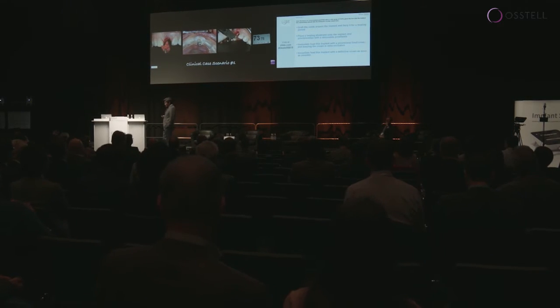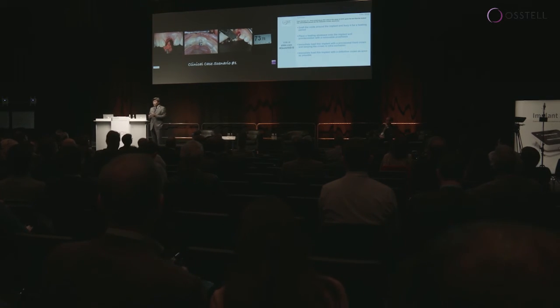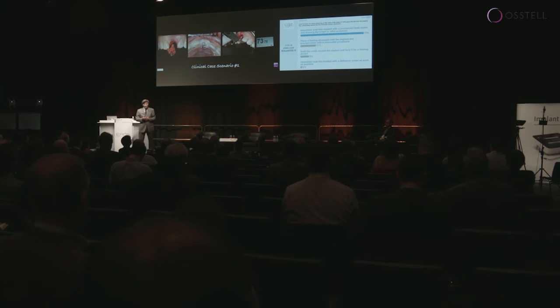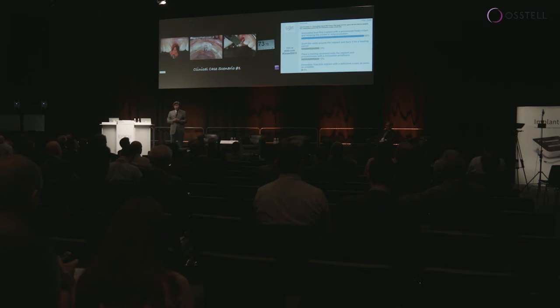Now, the reason why we're asking this is because this is everyday clinical decision making that you have to do if you're placing implants, and if your patient is demanding a fixed type of restoration. And so based on the surgery, based on the ISQ value, what would you do? How would you treat this patient? It will be interesting to see what your colleagues say.